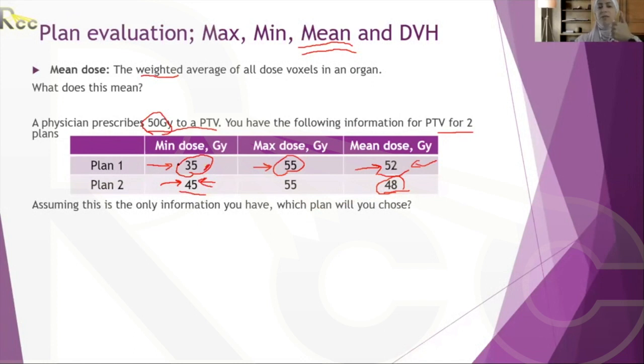Minimum dose is not affecting the overall coverage. And actually, the mean coverage is very high. So this means that, mathematically speaking, of course, a physicist looks at numbers. Mathematically speaking, it says very low number of voxels have this dose. However, even if this one is higher in number, a lot of the voxels are lower than prescription, and hence they are affecting the overall coverage.